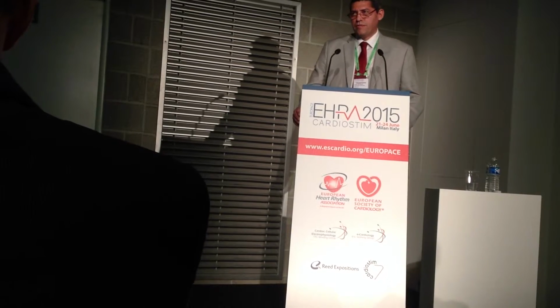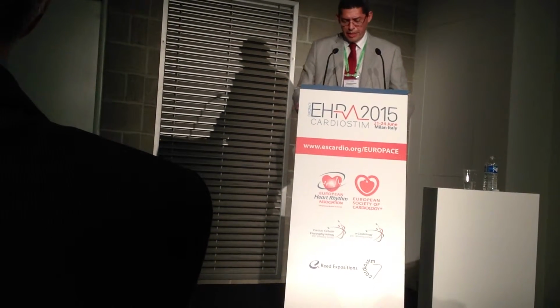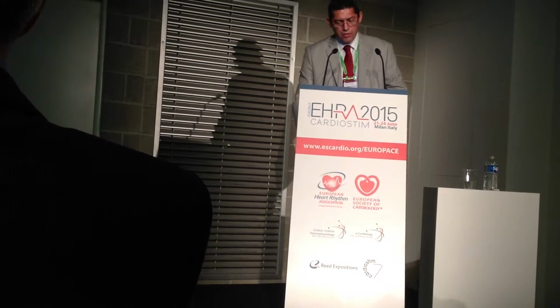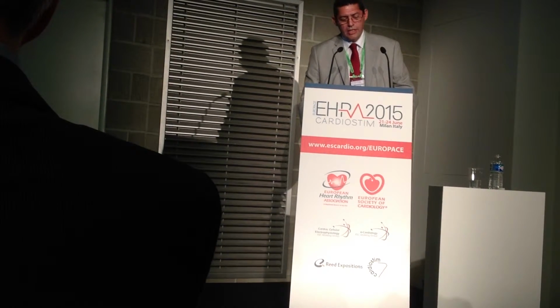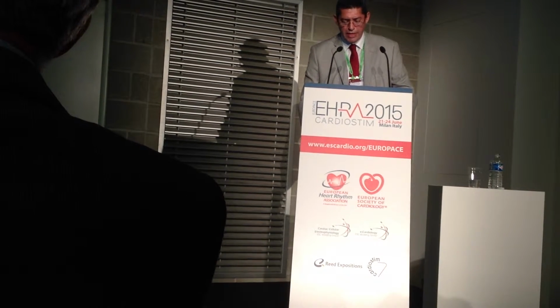The definition of acute successful ablation is the complete abolition of the arrhythmia. As you can see, in this case, during the application of radiofrequency, you can see the modification of the arrhythmia until its complete abolition. In this case, ablation in the RVOT using the simplified approach.